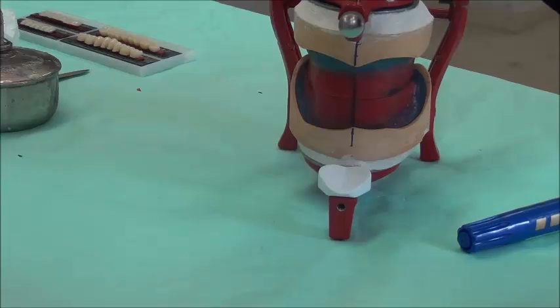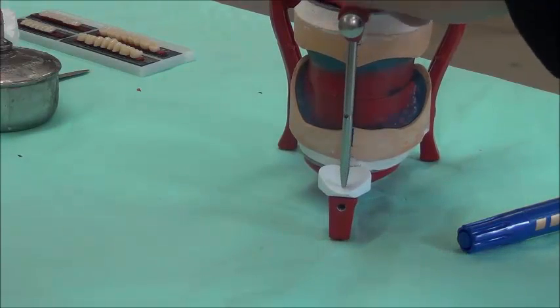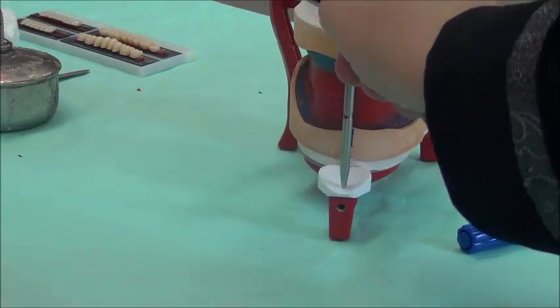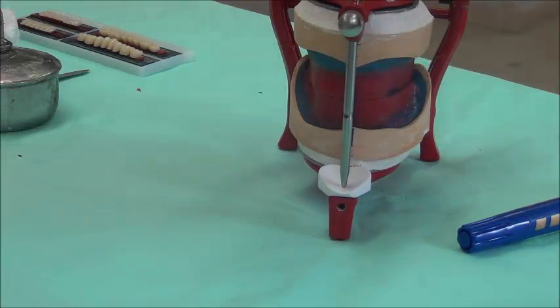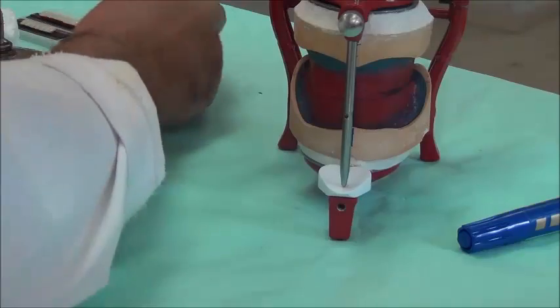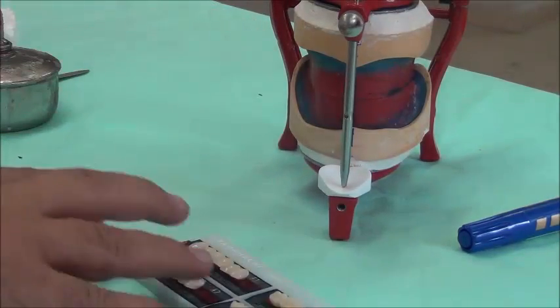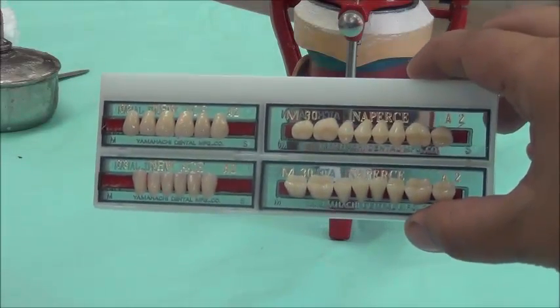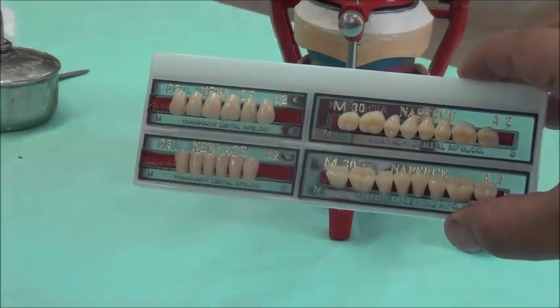Before doing the setting, we make sure that the pin is touching the table and the screw is secured. We will now present you with the teeth. The teeth are an acrylic mold — they are a fixed size for all students — and we will be using them for setting the case we have today.